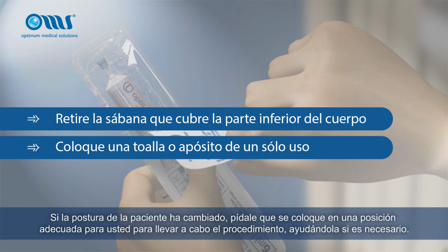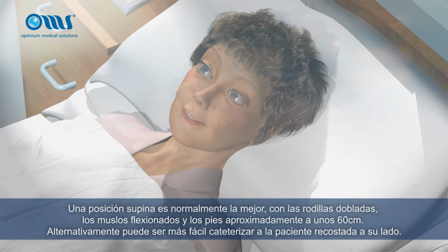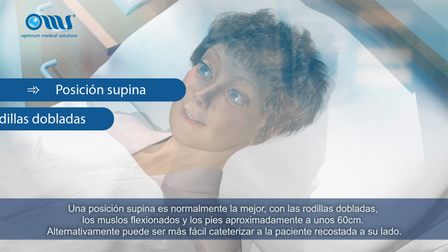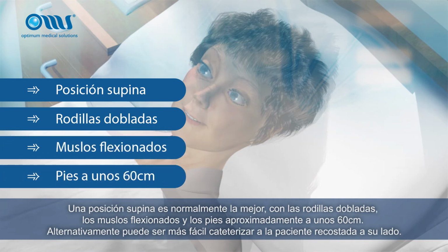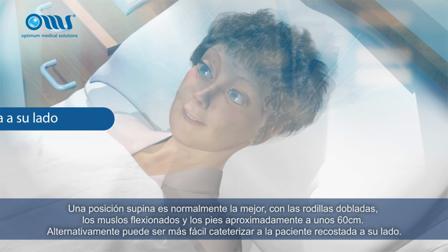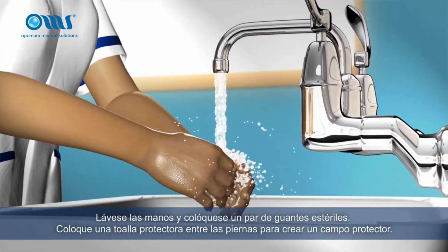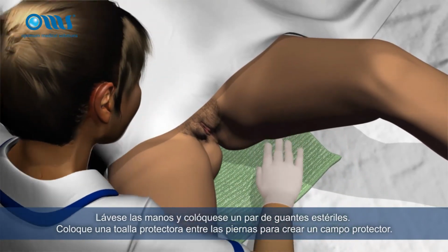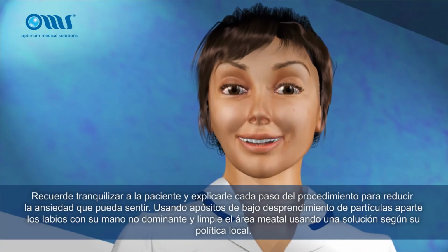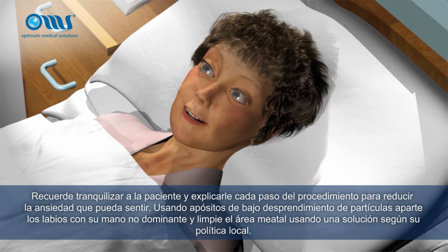If the patient's position has changed, ask her to get into a suitable position for you to carry out the procedure, helping if required. A supine position is usually best, with knees bent, hips flexed, and feet about 60 centimeters apart. Alternatively, it may be easier to catheterize the patient with her lying on her side. Wash your hands and put on a pair of sterile gloves. Place a sterile towel between the legs to create a protective field. Remember to reassure the lady and explain each step of the procedure to ease any anxiety she may be feeling.